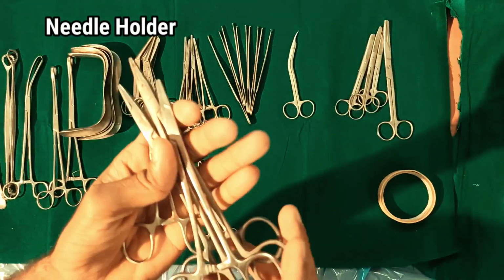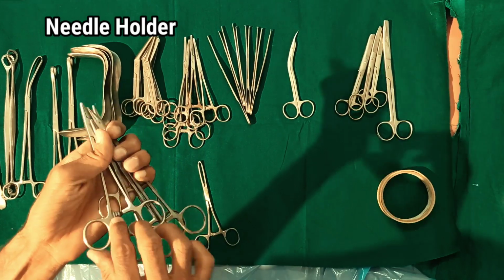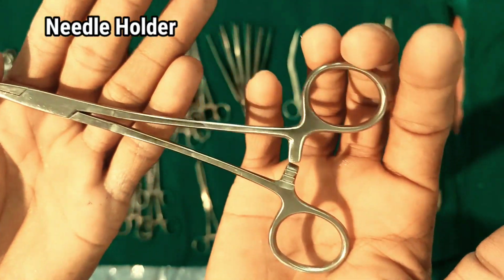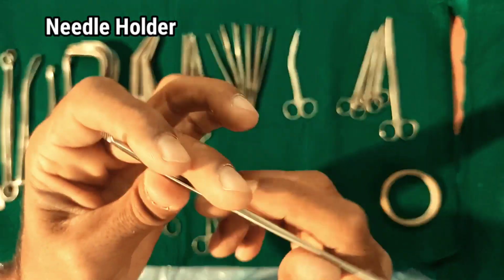Needle holder, also called needle driver or needle forceps. Needle forceps is a surgical instrument similar to a hemostat used by doctors and surgeons to hold and push a suturing needle when performing wound closure, ligation and other surgical procedures that require reanastomosis.